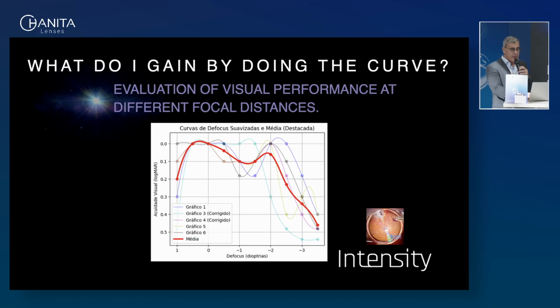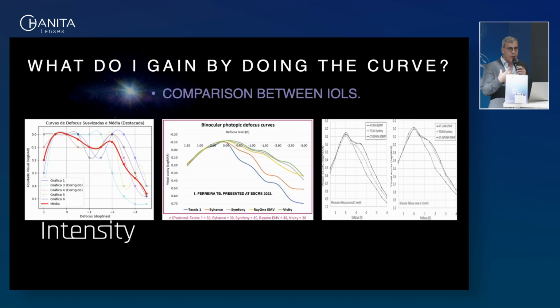And I think it is because of this. It does very well when it's -1, or in this range here, which would be like the plus half of a diopter. It has a very good performance. So I am safer on the positive side of the refraction target. And I get to evaluate intensity against all other lenses. It's very important for me.